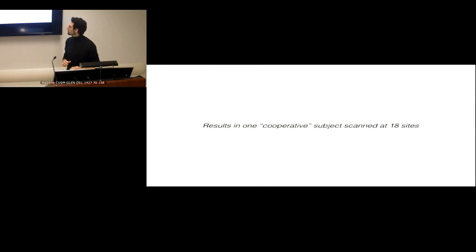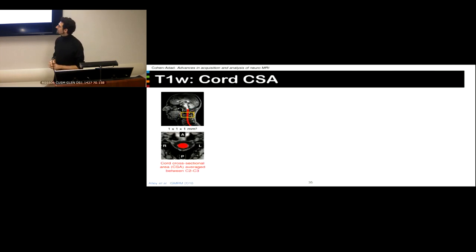So kind of a pre-validation was to scan someone across different sites. So this someone was me. So I'm lucky enough to travel. And not going to go through all the different sequences, but just to show you what we can get with this kind of standardized approach.